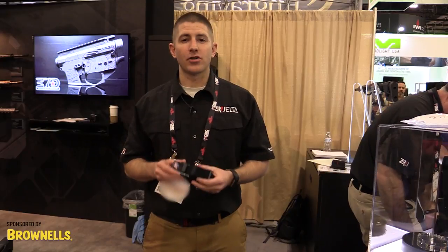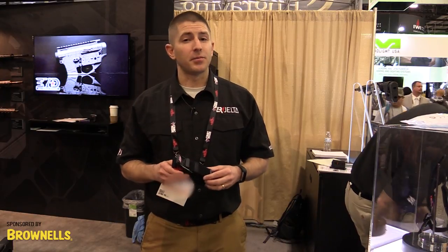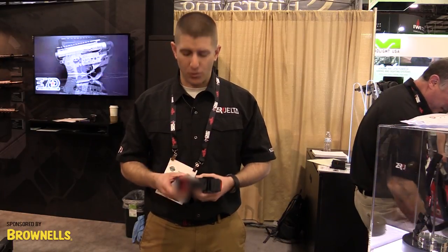Good afternoon, I'm Will with Zero Delta, and I'm here to introduce to you the HALO tourniquet. HALO stands for Hemorrhage Arresting Lever Operated Tourniquet. We feel that it is going to be the fastest, simplest, and most secure tourniquet on the market, and let me show you why.